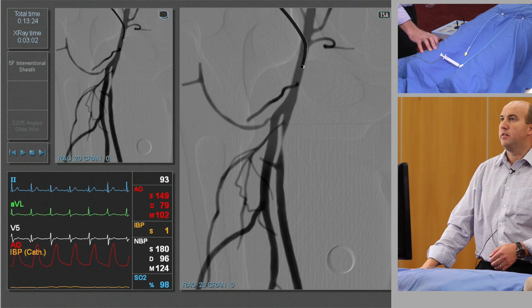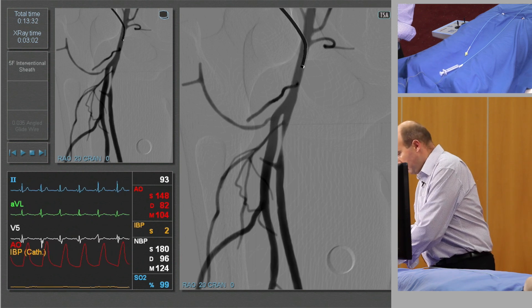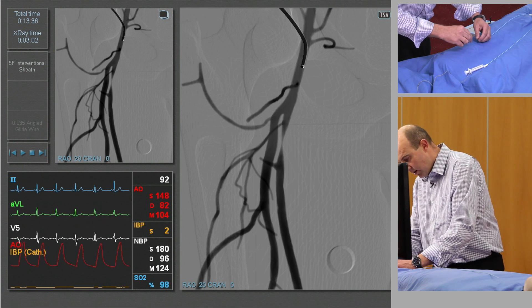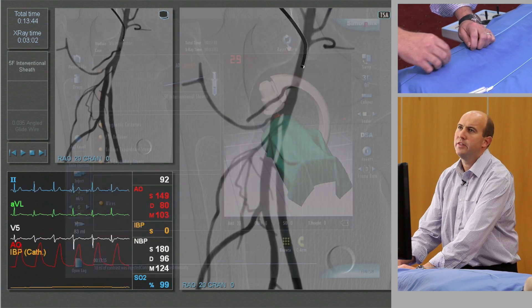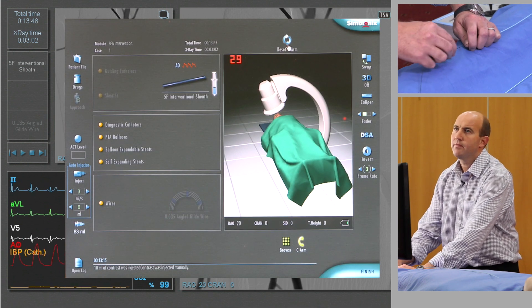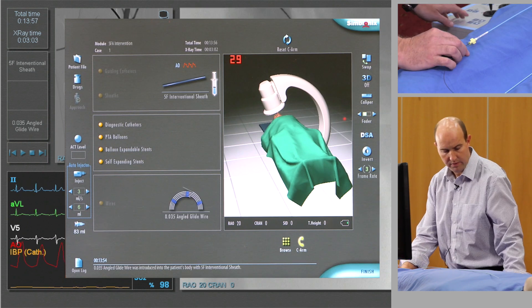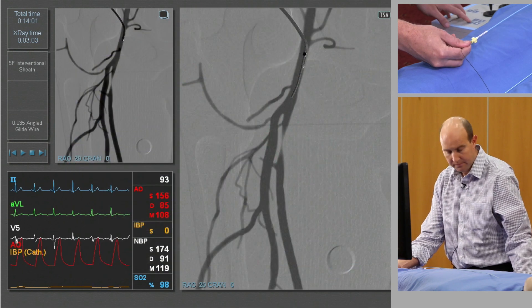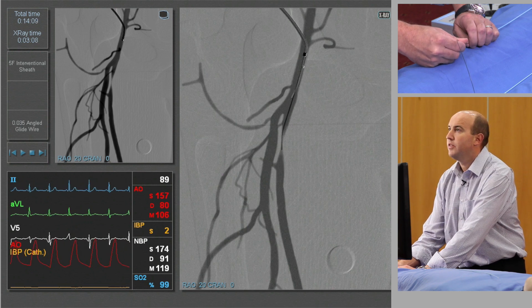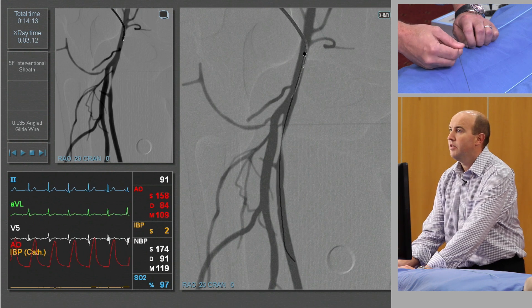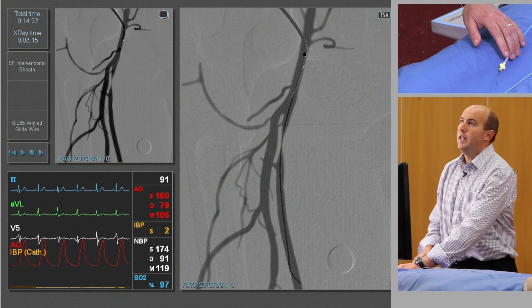So we have a sheath in. The next item to consider is the wire, which has been pre-selected — that's an 0.035 angled glide wire, which we pass through the sheath. Once it's engaged, you'll see the box on the left-hand side of the screen light up. You don't need to screen until you've actually got it engaged. There it is engaged. We just need to negotiate the wire across the lesion — good practice is to try not to take the wire off the bottom of the screen. We now have a wire across the intended angioplasty segment.